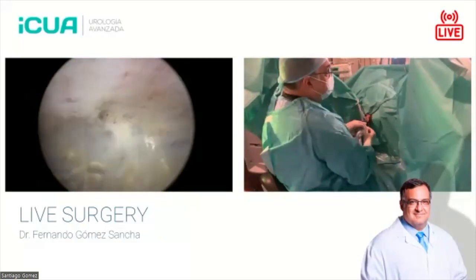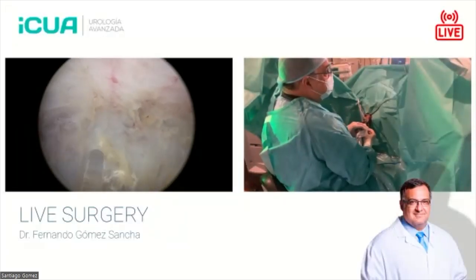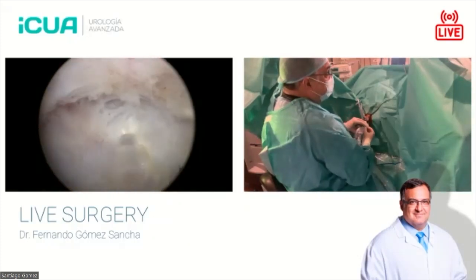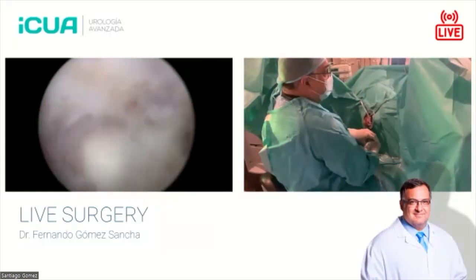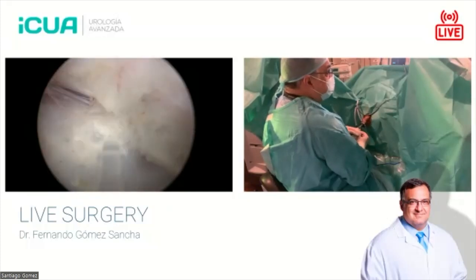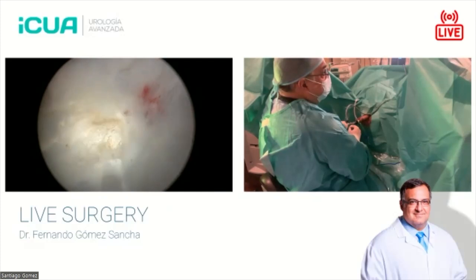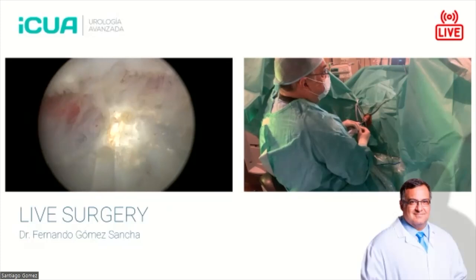And then of course, if this is the line of dissection, we can fire against the line like this. We could fire outside of the line, like in the capsular edge. And that, of course, is dangerous because we get deeper in the tissue. And then, of course, as the angles are changing between the capsule and the adenoma, the aiming of the laser is super important. So here I'm trying to develop the posterior line.